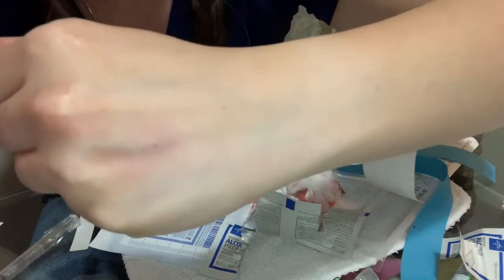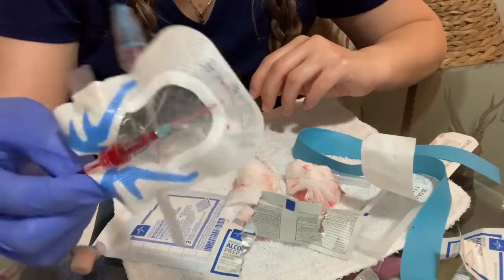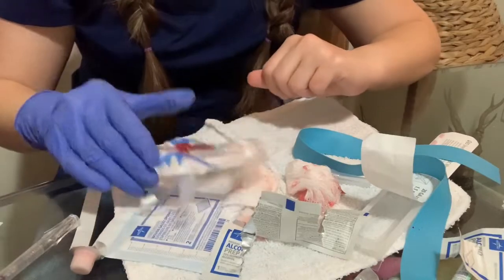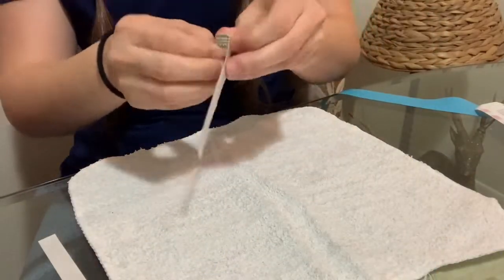I'm not bleeding at all — that's good. We place this in the sharps container and then place a bandage.